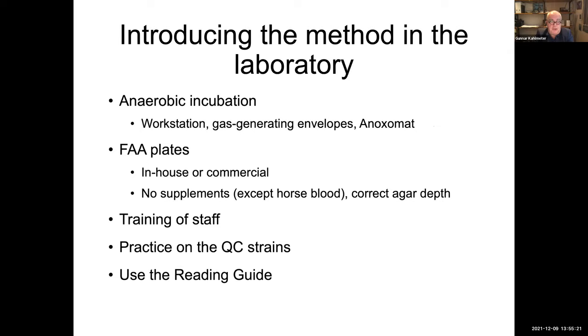I think the troubleshooting is very important to get right and understand what can actually go wrong. And you need to think about the various components of the test. And I could see that Audrey raised her hand. So please, Audrey, take it away.